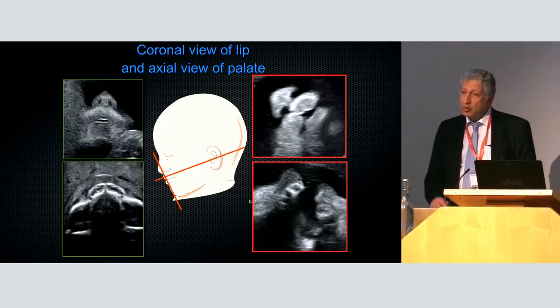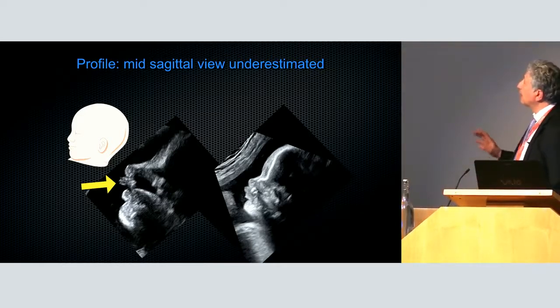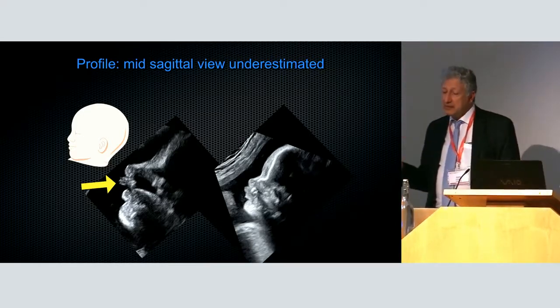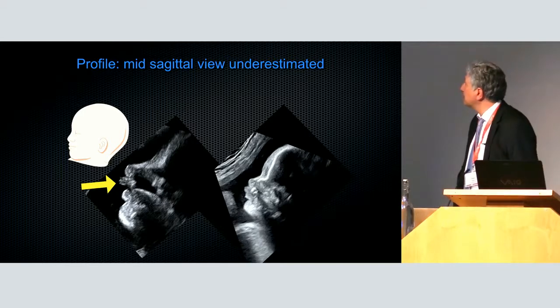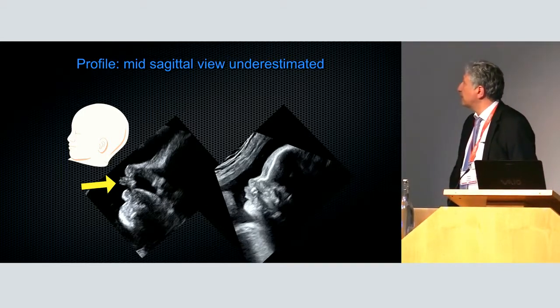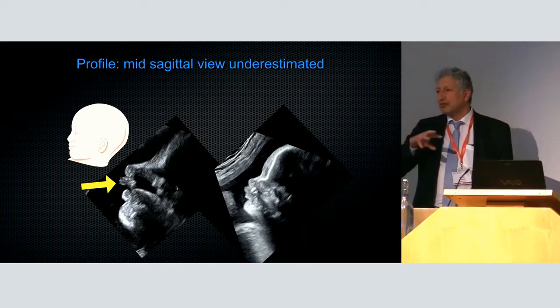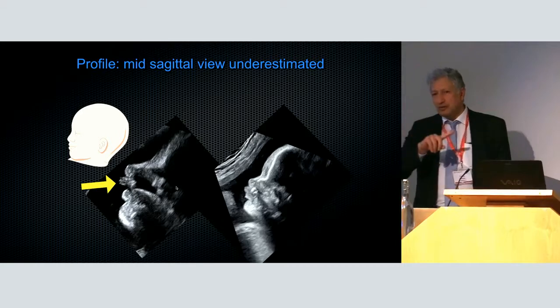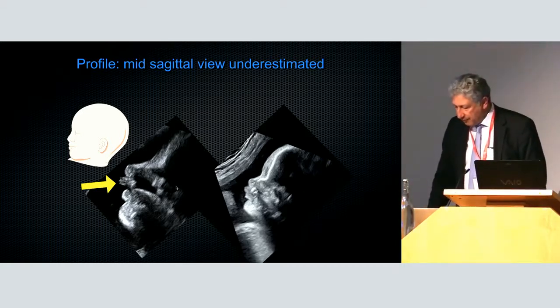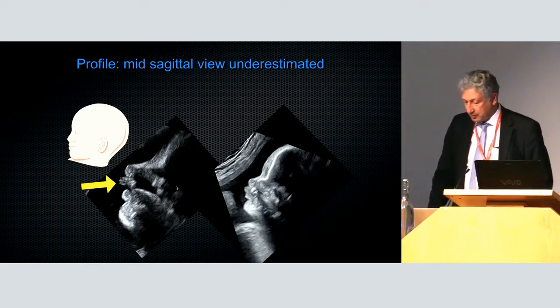But on the other hand, we were also taught that if you want to check, the profile may be misleading. This is why you may not see it, because here the profile may be normal, with the exception of cases where there is protrusion. And this is why we were discouraged to look at the profile as a screening tool for maxillary, let's say for cleft palate, and the other view was or is very important.